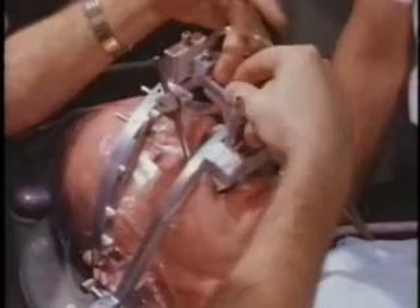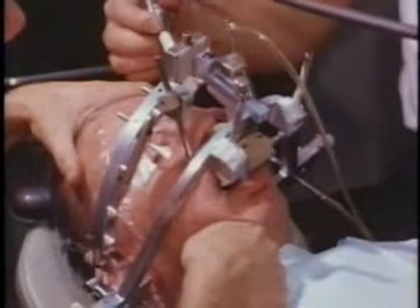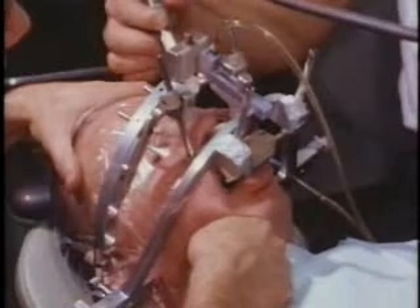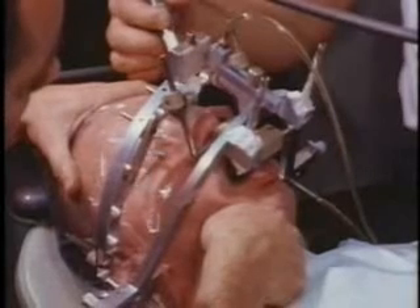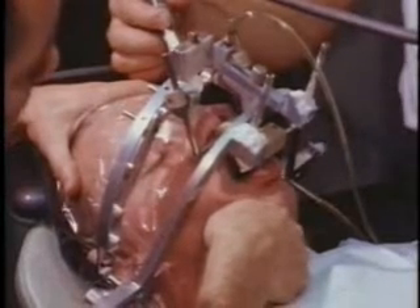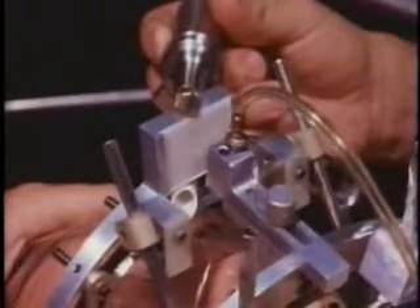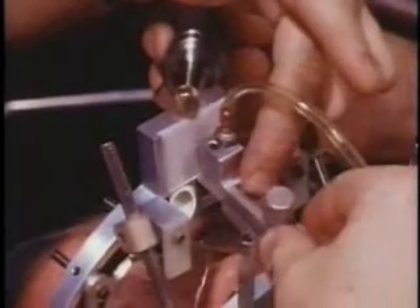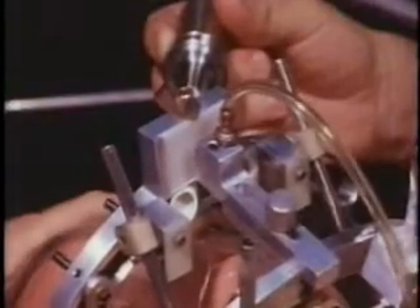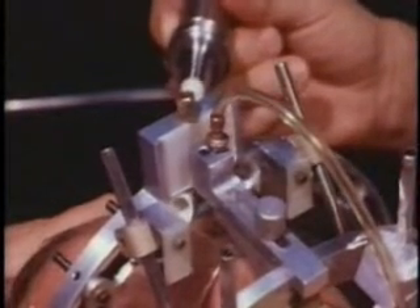The drill is locked at a depth indicated by a scale on the side of the turbine carriage. The left lateral border movement is recorded with the drill engraving a three-dimensional pathway. The mandible is returned to centric relation, the drill reinserted into the recording block at the same depth as before. The right lateral recording is accomplished by having the subject move his mandible slowly to the right while the drill cuts the pathway.